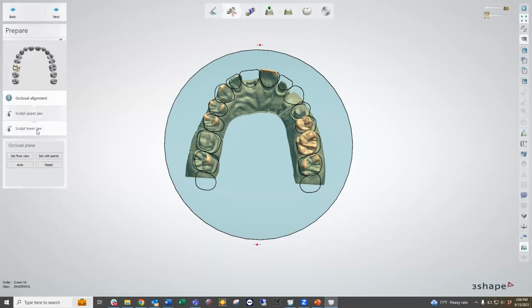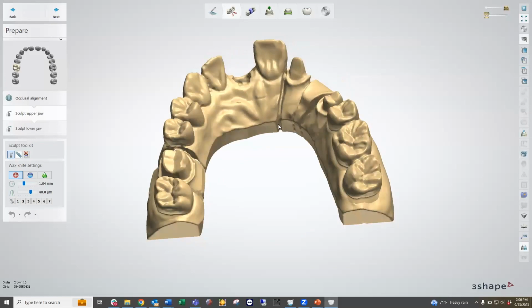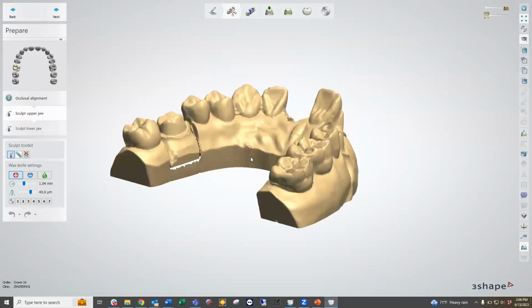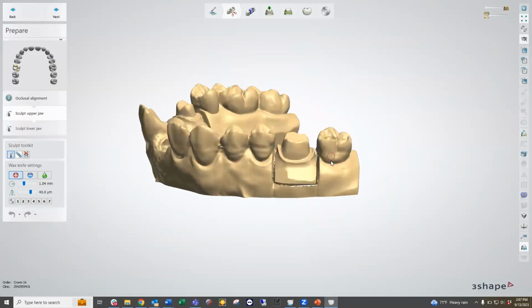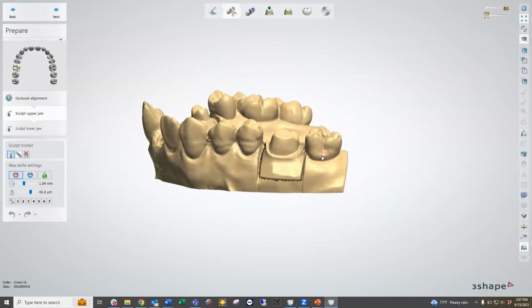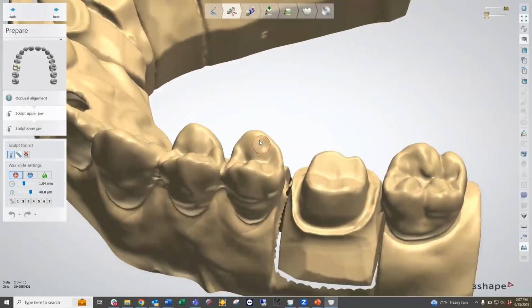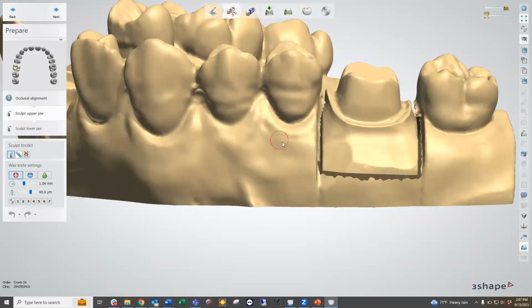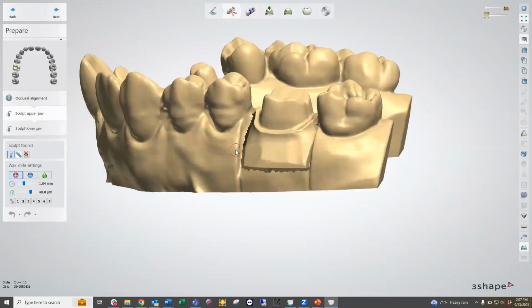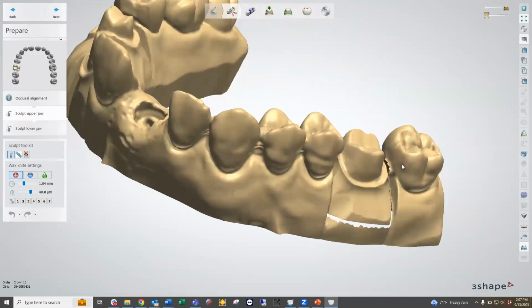Then we have two other options which allow us to do editing along the scans that we already have incorporated into our design. The first one is sculpting the upper jaw. At this point, we can take a very close look at our case and see if there are any imperfections that we would like to tackle. For instance, if there was a bubble on the model, we can fill that in or idealize it. Or if we had any ridges or inverted triangles that might be an issue with our design developing into these interproximal areas, we can adjust that now as well.